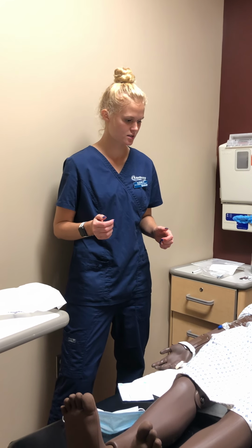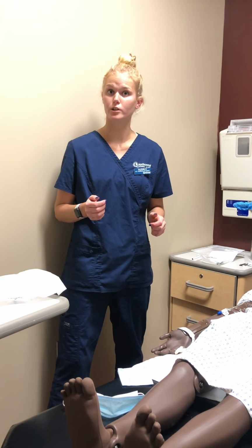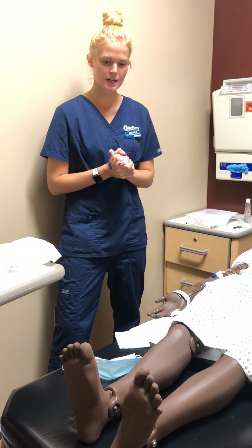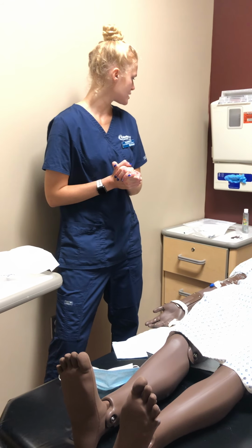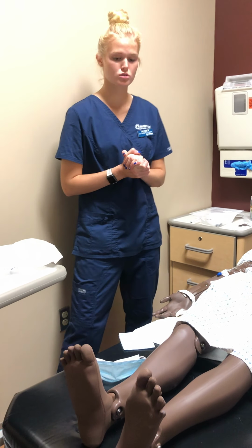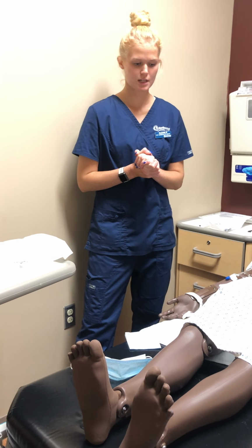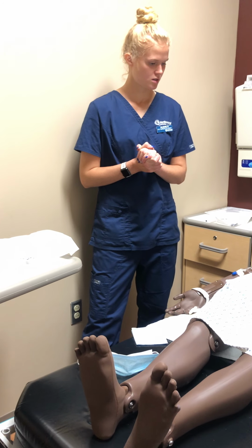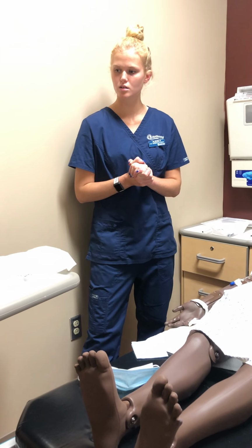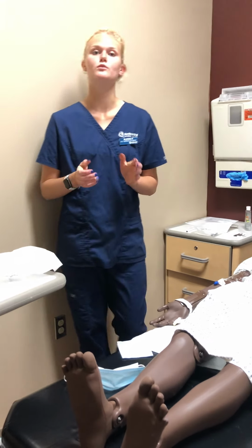and then I would ensure to document how the patient tolerated the procedure, and then I would want to wash my hands, and then dispose of my supplies, and then make sure to wash my hands. I'm done with this skill.